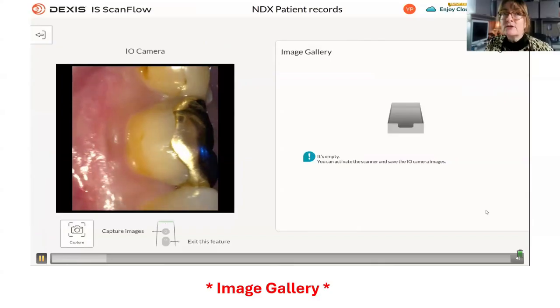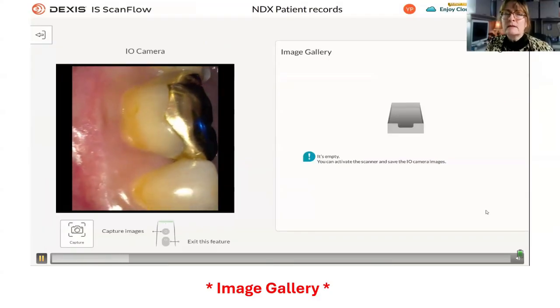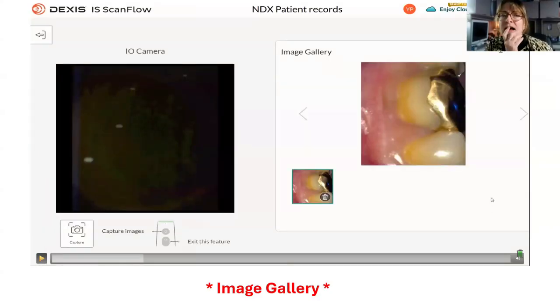I actually have one on that. So you said, can you pause the video for a sec? That there's 9 different intraoral images from one full arch. Is that correct? Yeah, so wherever we click with the cursor on the tooth of the full arch, it'll grab 9 images in a little bit of a different angle. And from those 9 images, we can pick the one that we like. Another way to explain that, Kelly, is that on my phone, I have a burst feature, and it gives me 10 pictures in 3 seconds, and I just save the one that I like.